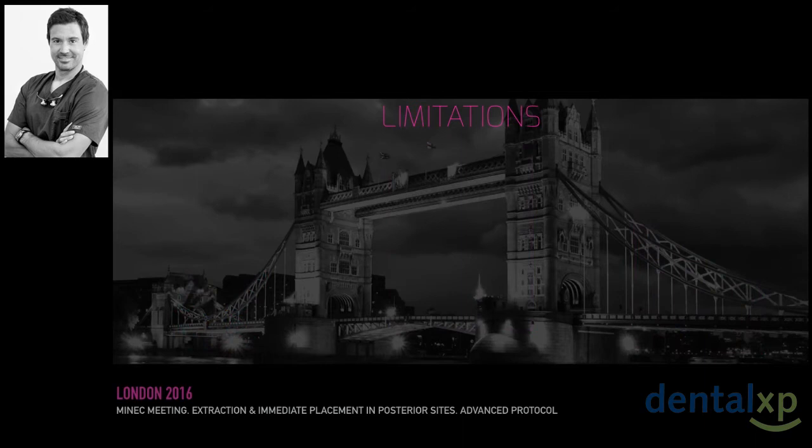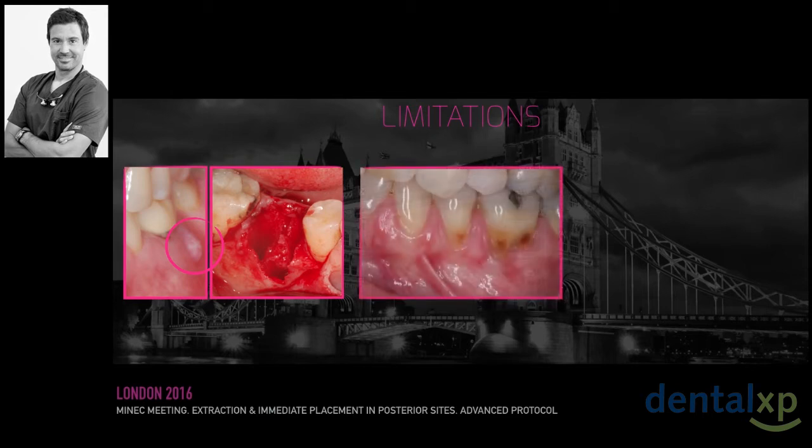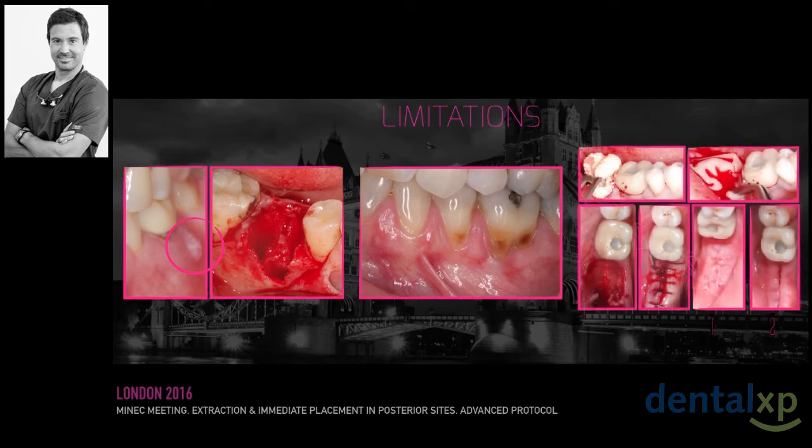The absence of buccal wall because of infection or traumatic extraction may affect the outcomes and limit our protocol, and it is recommended to proceed with socket preservation and staging our approach. Soft tissue deficiency, either in buccal or lingual walls, may limit the surgical procedure by losing the references for proper implant position. And when we have no bone to place our implant, we must sometimes give up and do what we have to do: socket preservation.